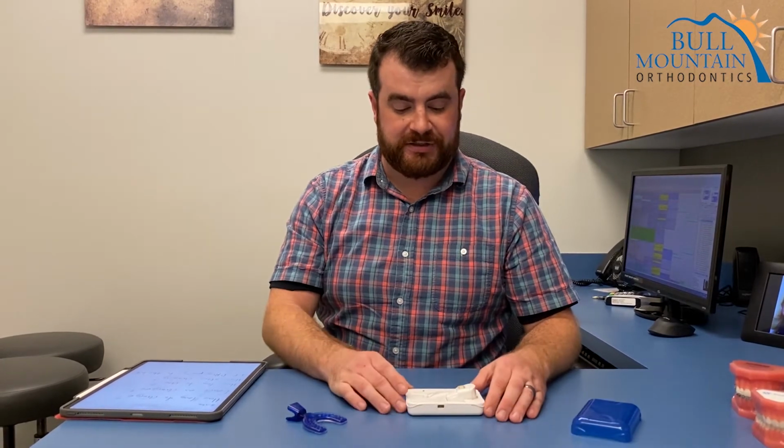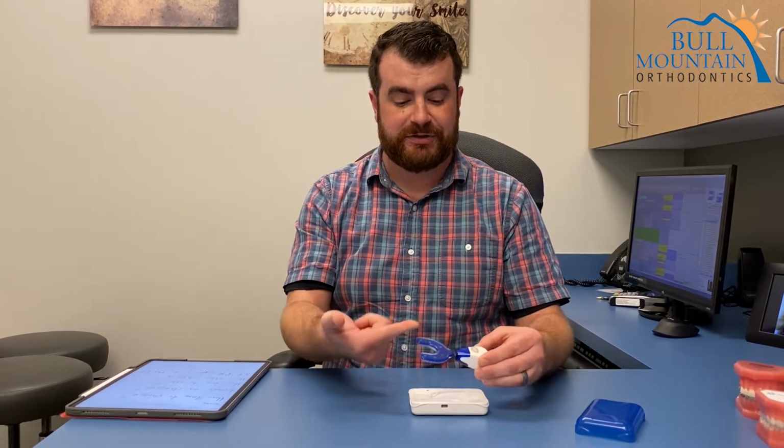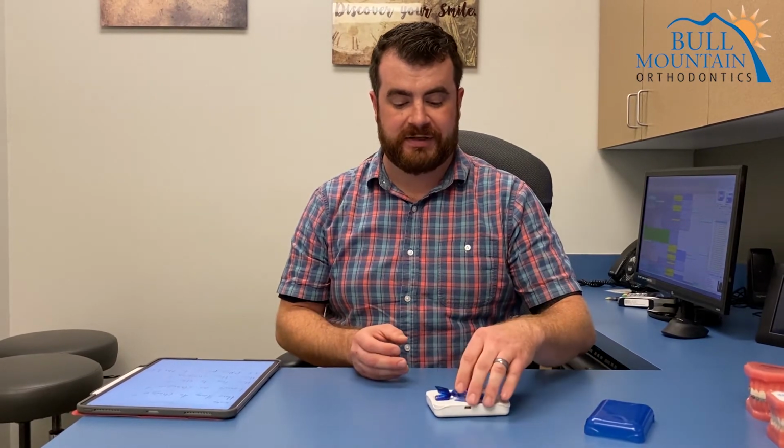When making sure to charge properly, make sure this is set in with the mouthpiece detached. So not like this, that was not going to work. You need to detach it and set it in like this. And if you want to store your mouthpiece, plug it in right here. A micro USB cord plugs in here, and then make sure it plugs in on the other side of the wall. If you happen to lose your micro USB cord, any other micro USB cord you have in your household will be just fine. And you can always pick one up at a gas station for $5 or something like that, just to make sure you meet your needs in the meantime.